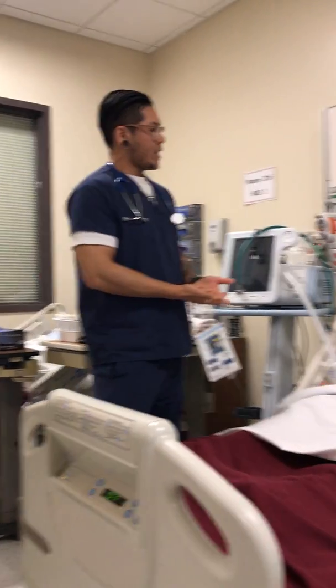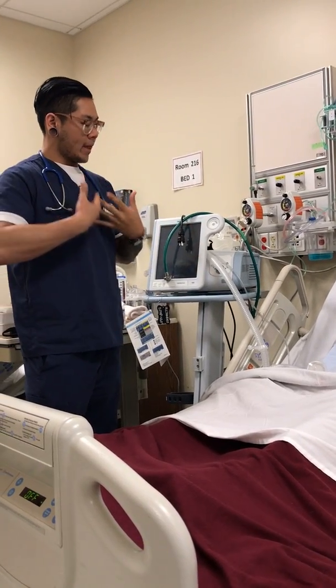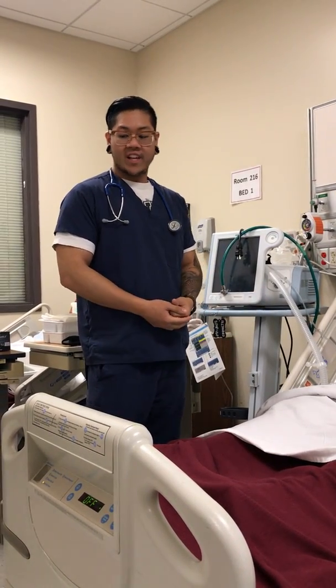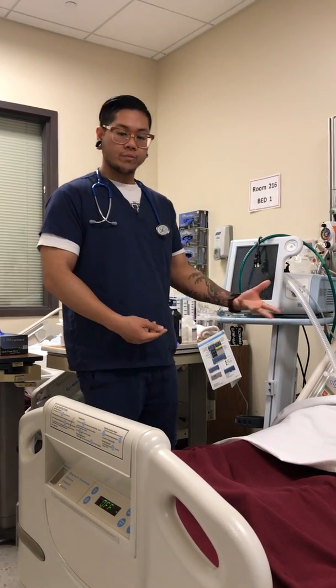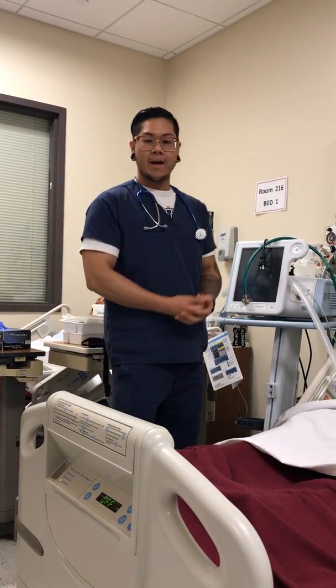Hello, my name is Scott, and I'm a respiratory therapist. Today, I'm going to be putting on a BiPAP machine, which is going to be helping open up your lungs and help with your work of breathing. It's going to help you breathe a little easier, okay? Explain to your patient, and then ask him for their first name, date of birth, and medical record number. Okay, Mr. Parker's right here. Him and the family understand what's going to happen.